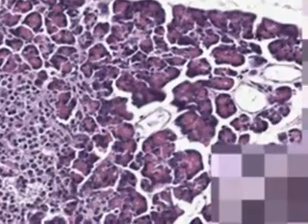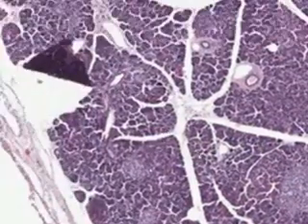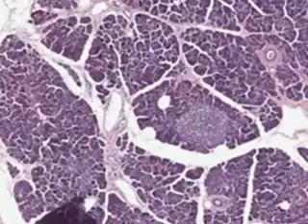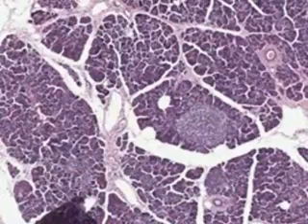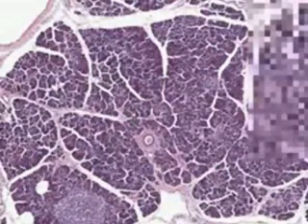Let's find an intralobular duct. And to do that, let's back up rather than waste our time. I think we could probably, oh, look at that beautiful islet right there. Look how well defined that is. Look at all the acini around it with the zymogen granules and some centroacinar cells.